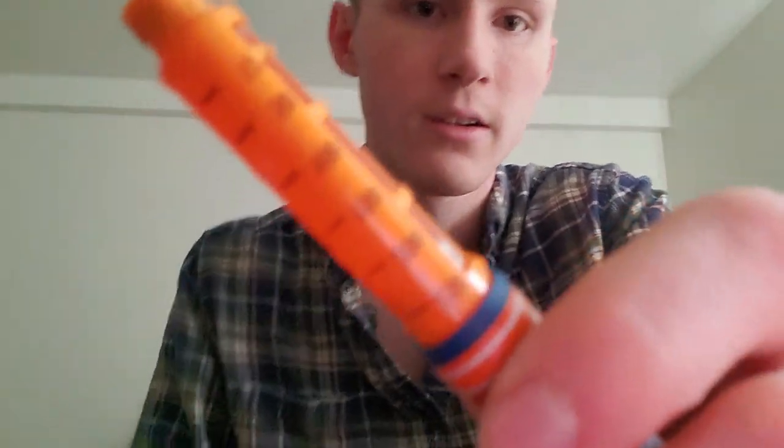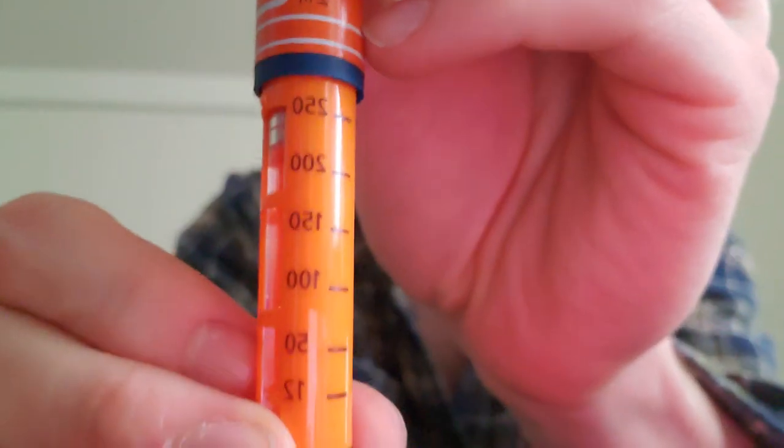So I already have my dosage set for how much I need. This is what it typically looks like, right? You have your measurements on the side there. There we go. There's the insulin. For most insulin, or at least mine, I'm not sure if there's changes depending on the type of insulin, I keep it stored in the refrigerator. Keep it cold until it's opened and used. Once it's opened and used, I have either until it's empty or 28 days after I open and start using it until it expires. So that's pretty much how I store it and how I know to switch it out with the next set of insulin.